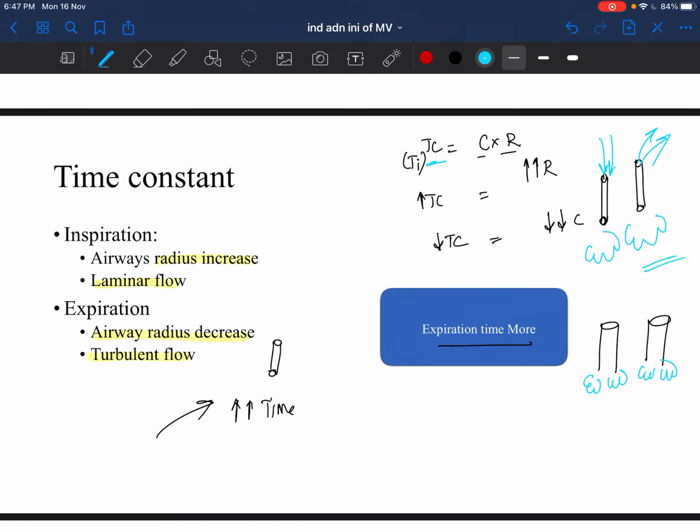Okay. So, why is the inspiratory time very less or the time constant less? So, imagine this alveoli which is normal. Imagine this alveoli which is stiff. So, here you have air entering in. Okay, this alveoli expands, it fills out with air at say 20 PIP, just an example. Okay. So, 20 inspiratory pressure, it fills with 50 ml of volume, again all theoretical. So, this is an alveoli which needs to be filled with 50 ml.